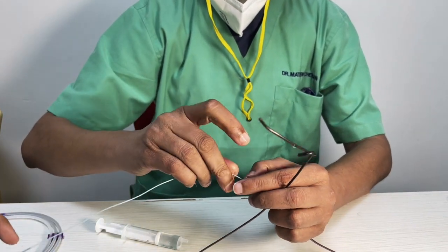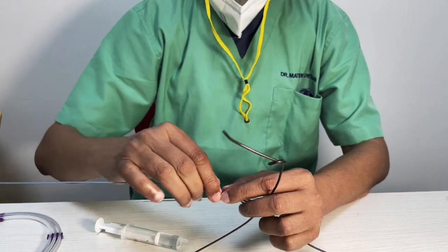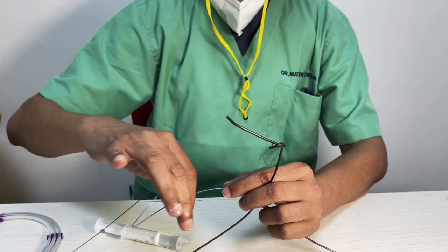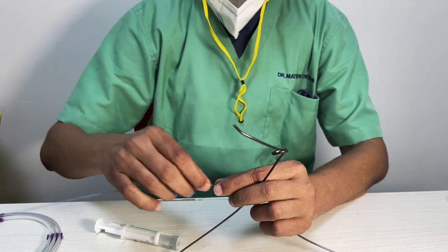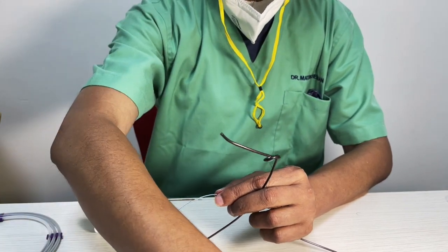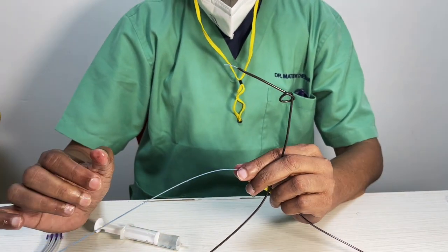So remember, all the catheters have certain simple facilities. All of them have a lube coating. All of them are made with different polymers. But the braiding in this is nitinol from end to end. Remember? Now, what was the difference? Penumbra used stainless steel because they felt pushability was the most important thing. Can you see that? Isn't that astounding?